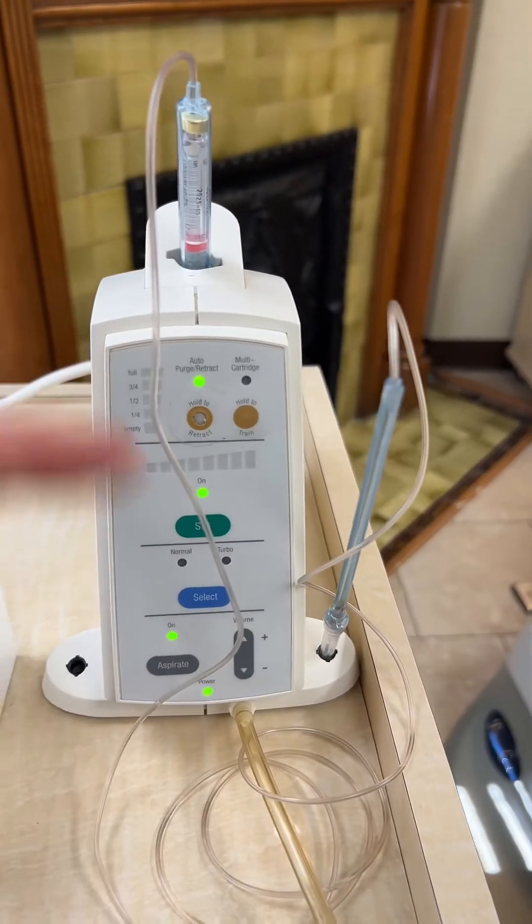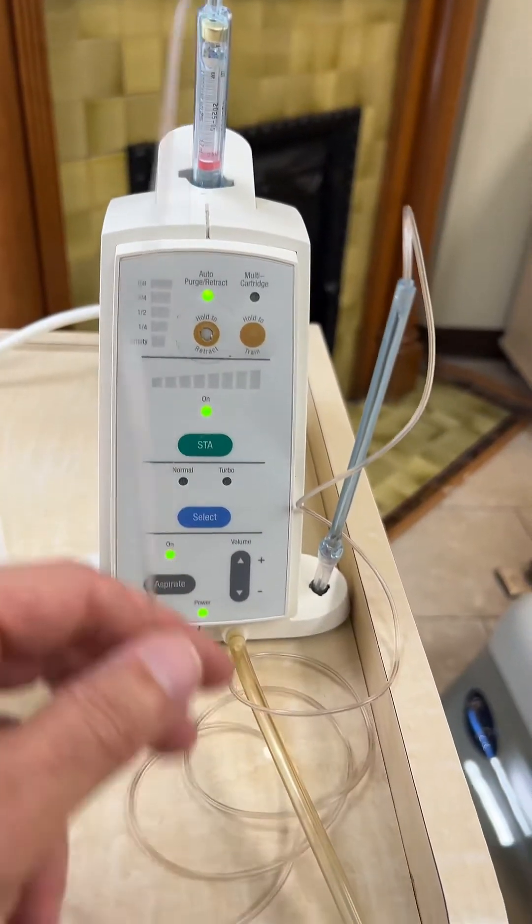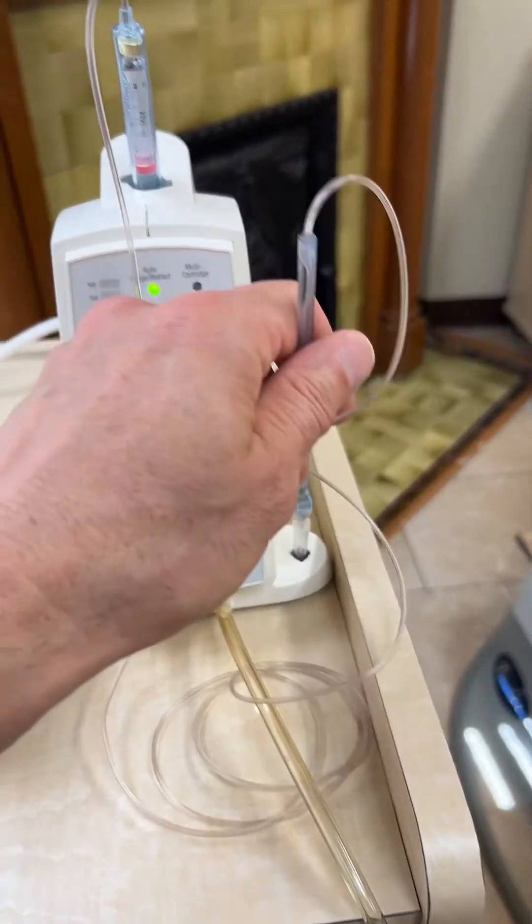This is the unit — you put the local anesthetics here, and then it has a hose and a needle. It has a really tiny needle, so basically you infiltrate around the tooth and it gets the tooth really numb, and it works right away.